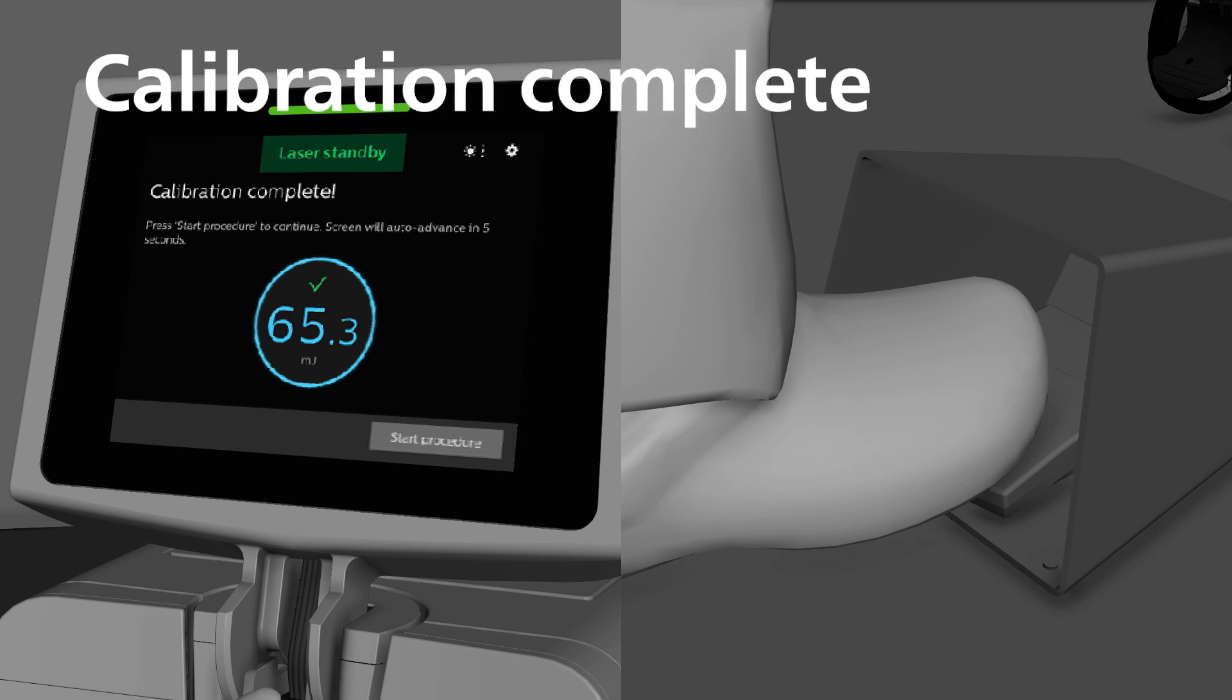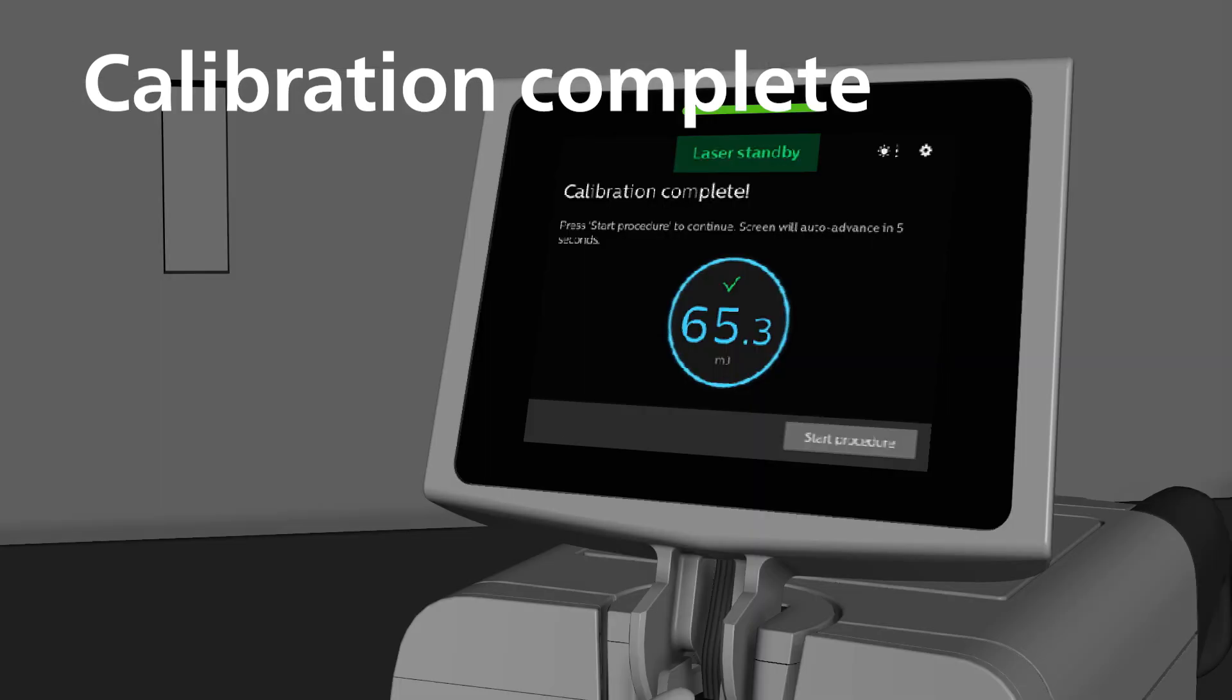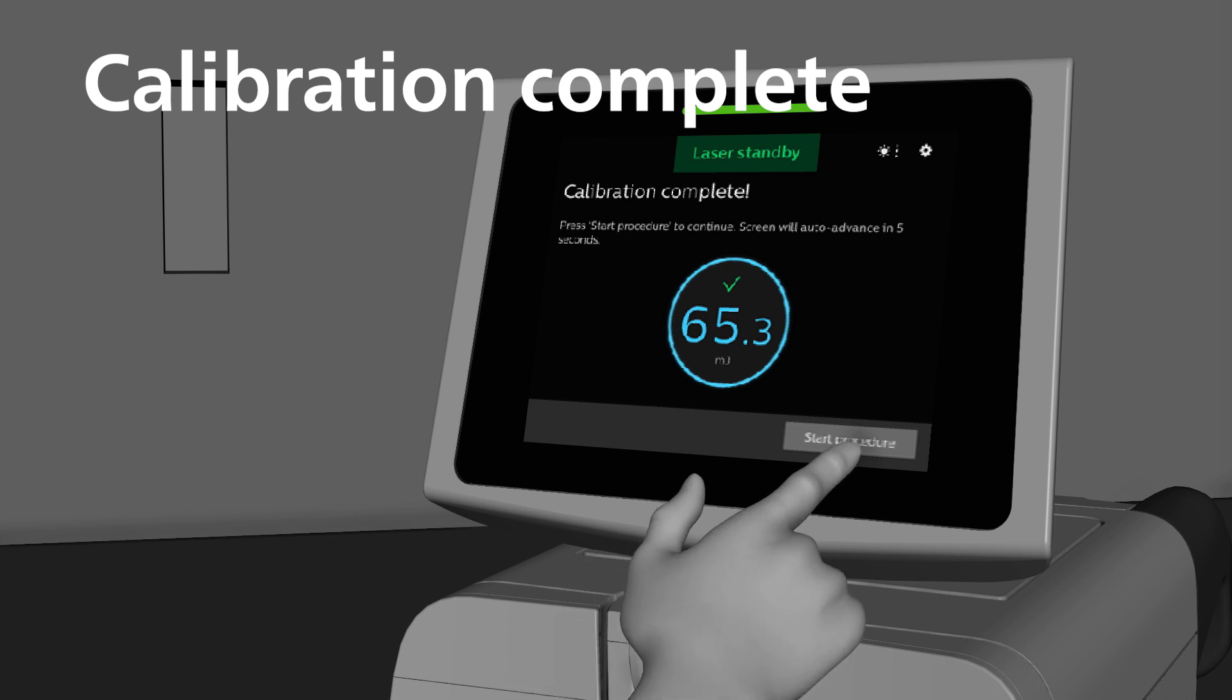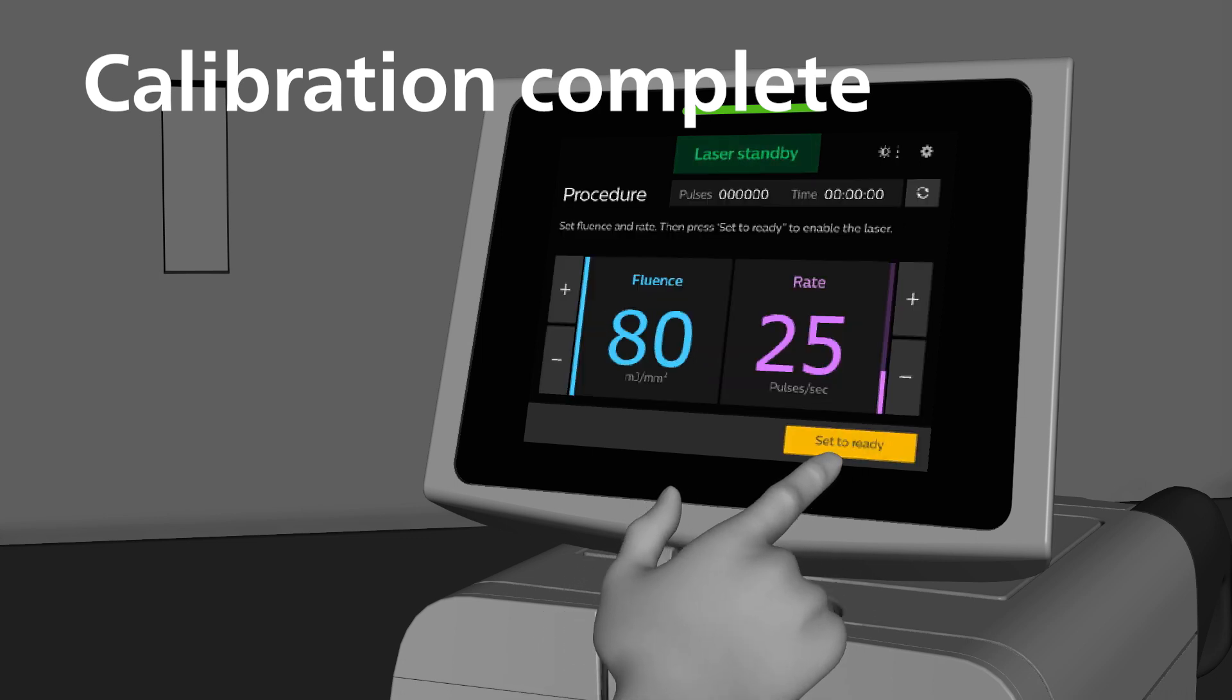Once calibration is complete, the system will display the calibration complete screen. The calibration energy is displayed to compare the calibration energy reading with the energy range for the fiber optic catheter selected. See catheter package for appropriate ranges. The system will auto-advance to the procedure screen in 5 seconds. This may be bypassed by pressing Start Procedure button.